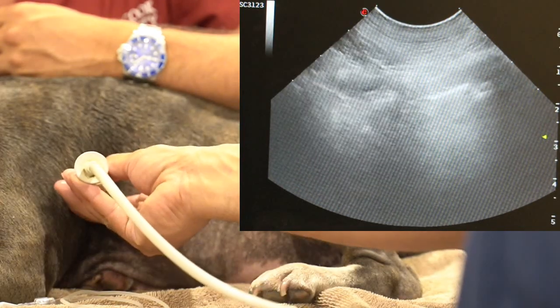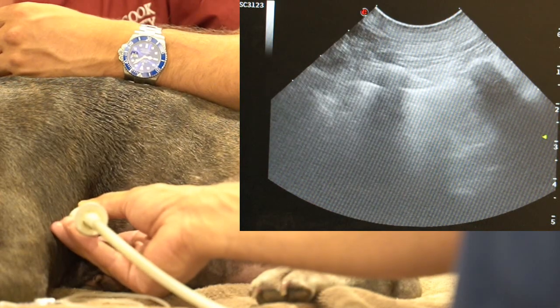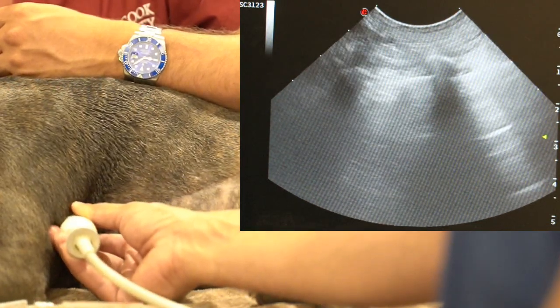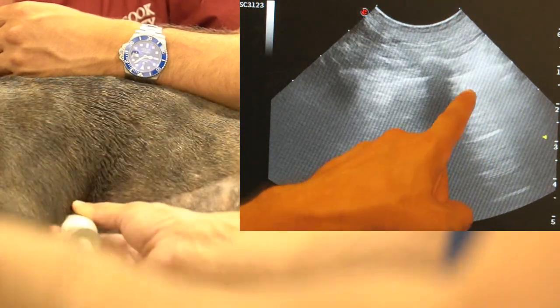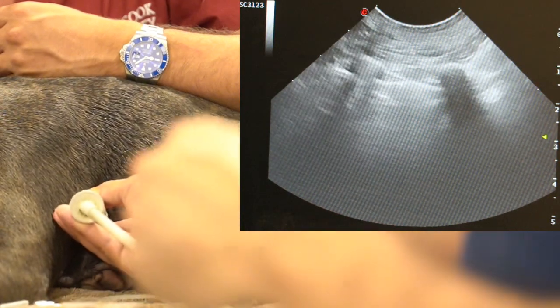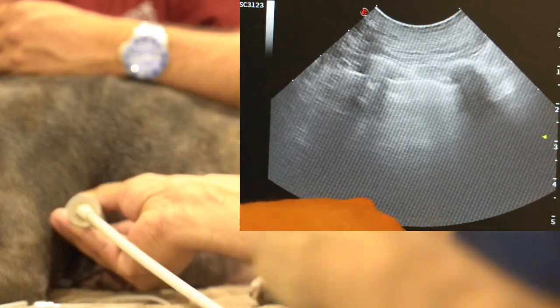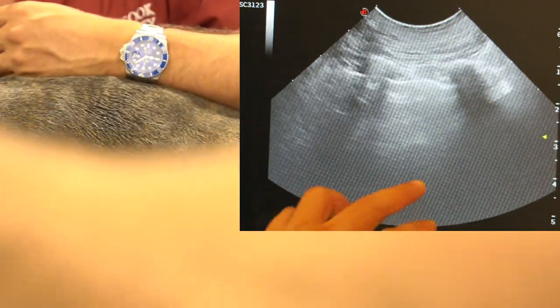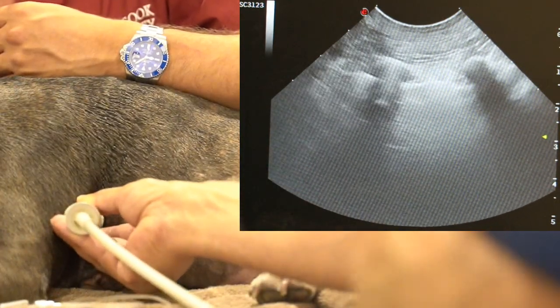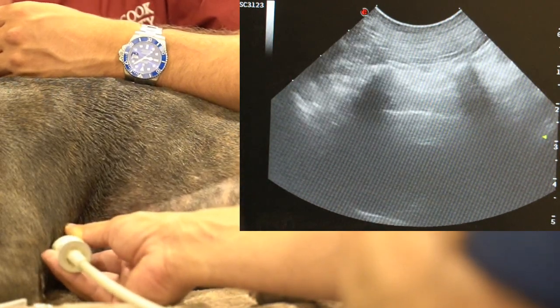Then we go further down cranially and ventrally, going over the heart superiorly. We're now in the ventral lung fields and we have A lines again. There appears to be some B lines, but true B lines would obliterate the A lines and go straight through to the other end of the field. What we find here is tapering, so that's not a B line. We also have the heart there, which is not uncommon to see beating.